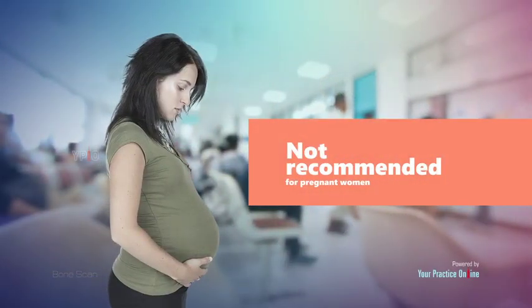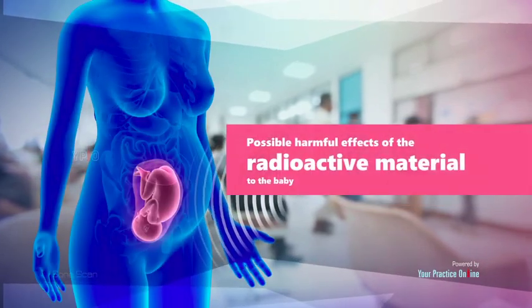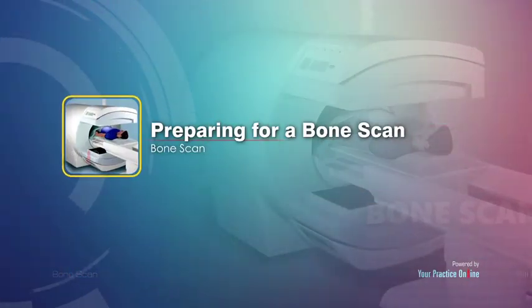Contraindications. Bone scans are not recommended for pregnant women due to the possible harmful effects of the radioactive material to the baby. Preparing for a bone scan.